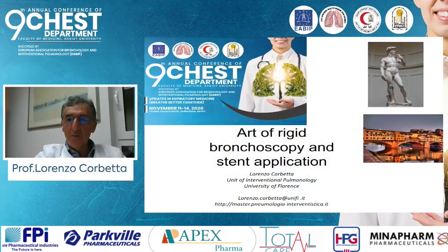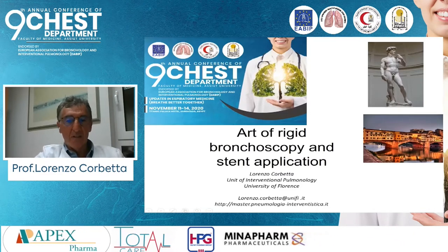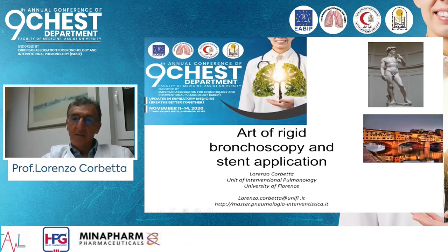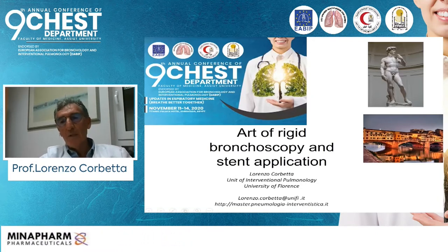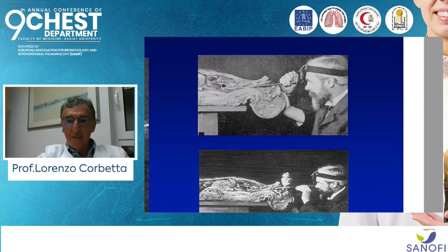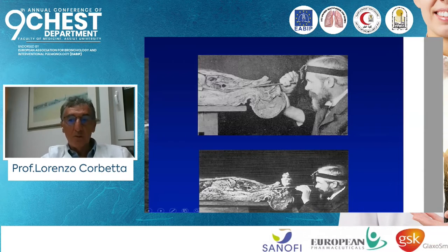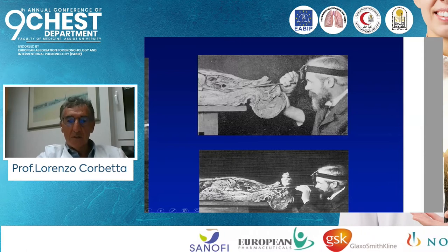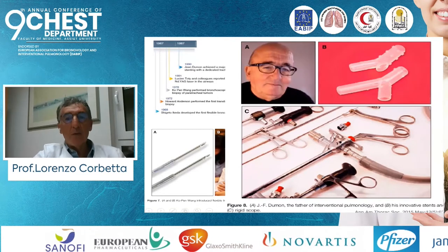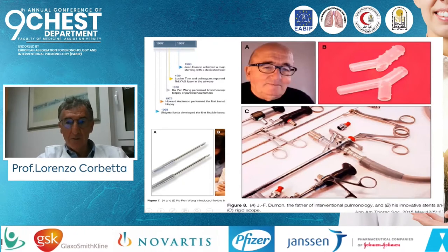My friends from wonderful Egypt, thank you for your invitation also this year. My topic will be the art of rigid bronchoscopy and stent application. You know that this art began with Killian more than 100 years ago, but it was this big man, Professor Dumont, who introduced these procedures again 30 years ago to treat the strictures of airways, with the use of the new stents and the laser inside the airways.